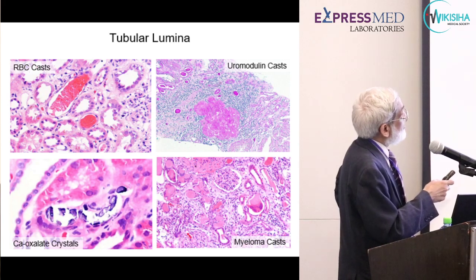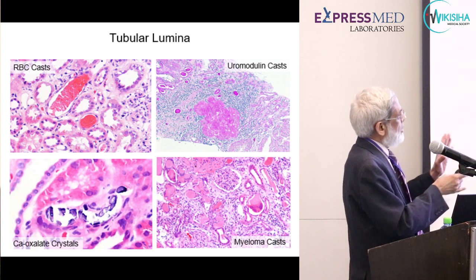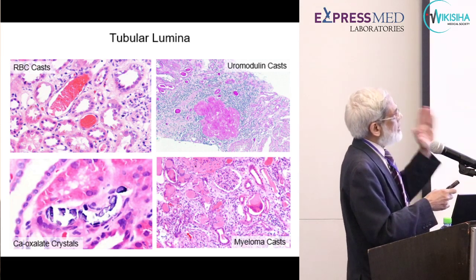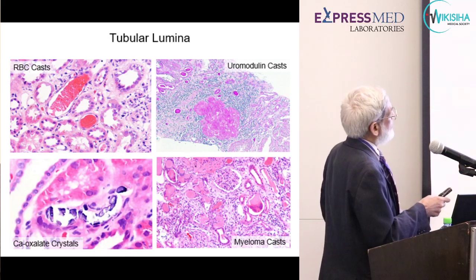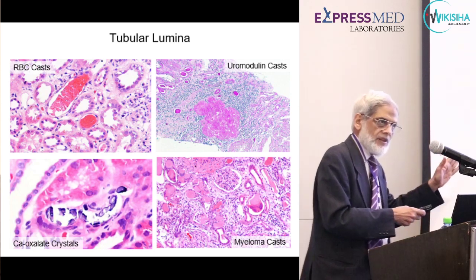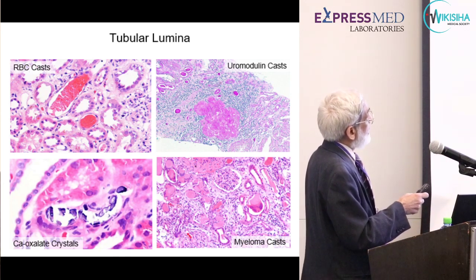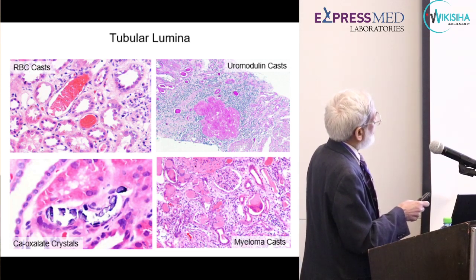So in cases of, say, vasculitis, which is very focal, all the glomeruli in the biopsy core may not show any lesion at all, but you see a lot of RBC casts. Therefore, that is a hint to cut deeper into the biopsy to look for a focal glomerular lesion. Very important to recognize. Also remember, at the edge of the biopsy, you will find a few red blood cells. They don't count. They are due to the surgical trauma of the biopsy itself. The casts are in the middle of the biopsy, and they have to be fairly compact cores of red blood cells. Incidentally, there is also some acute tubular injury.